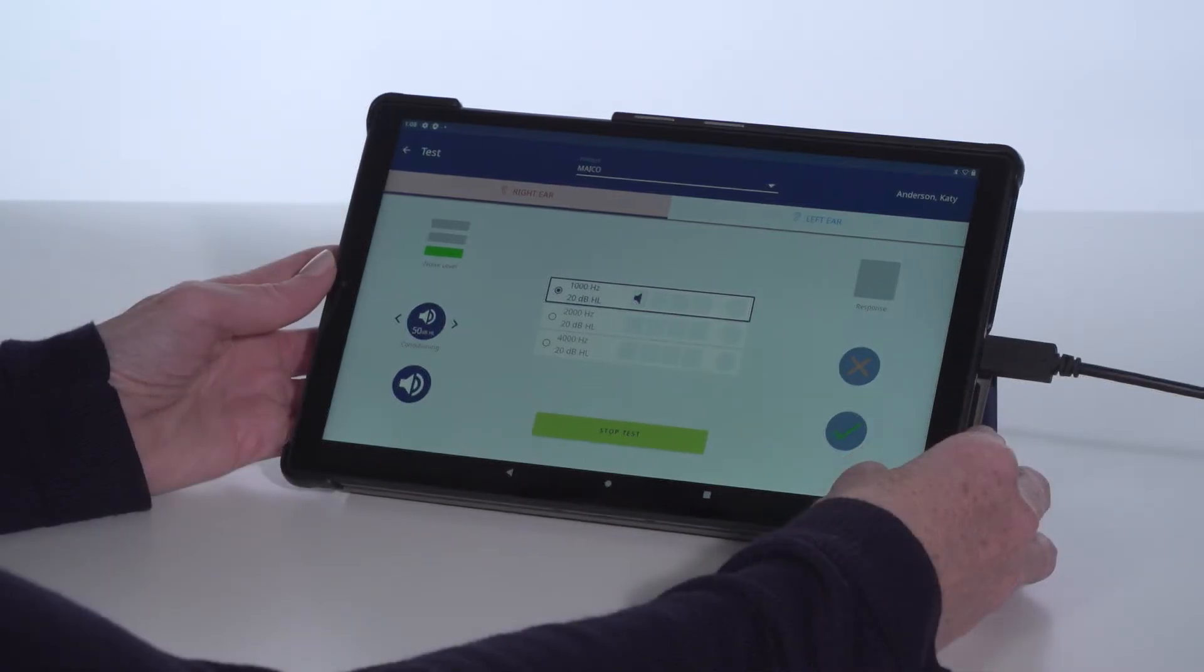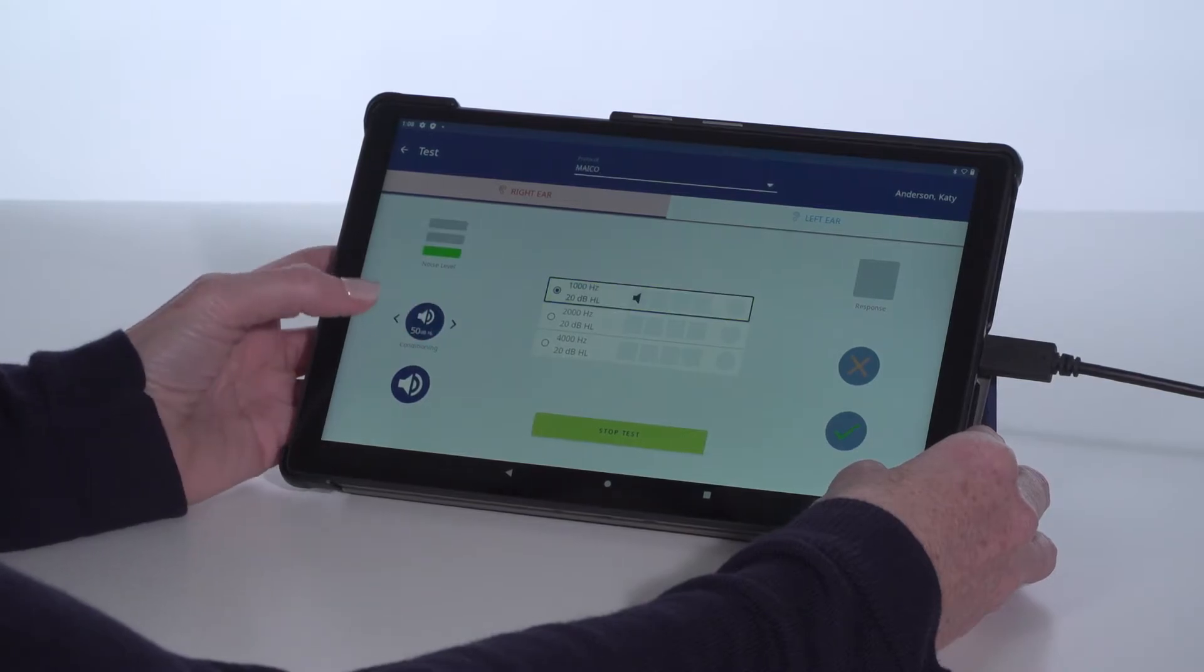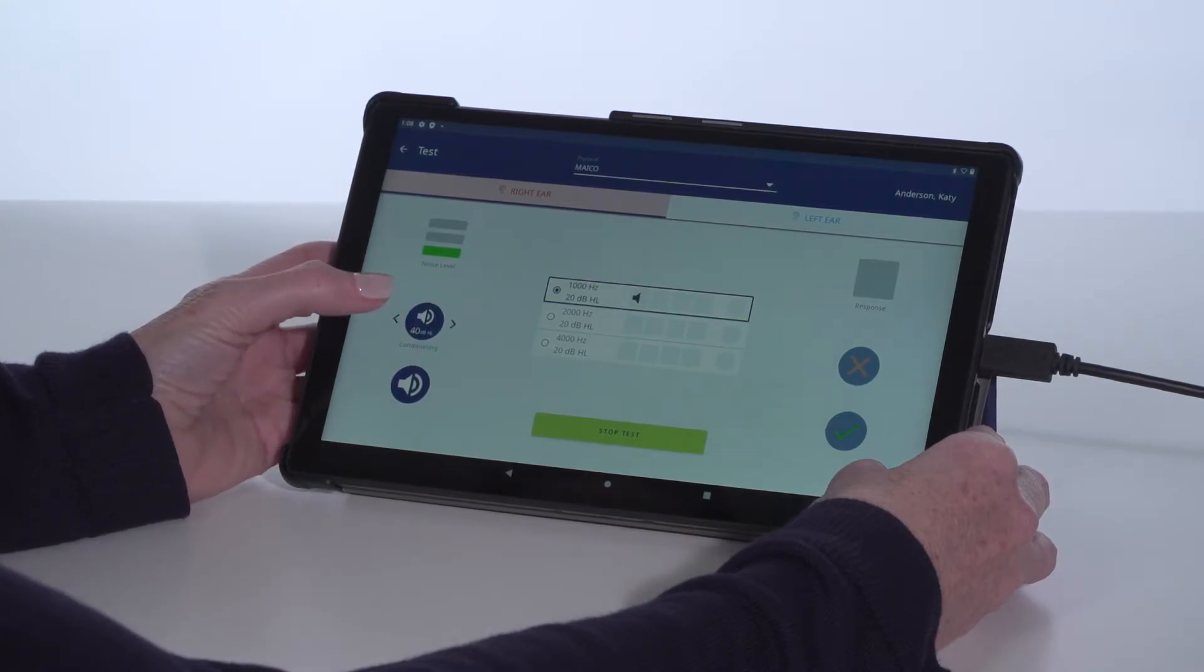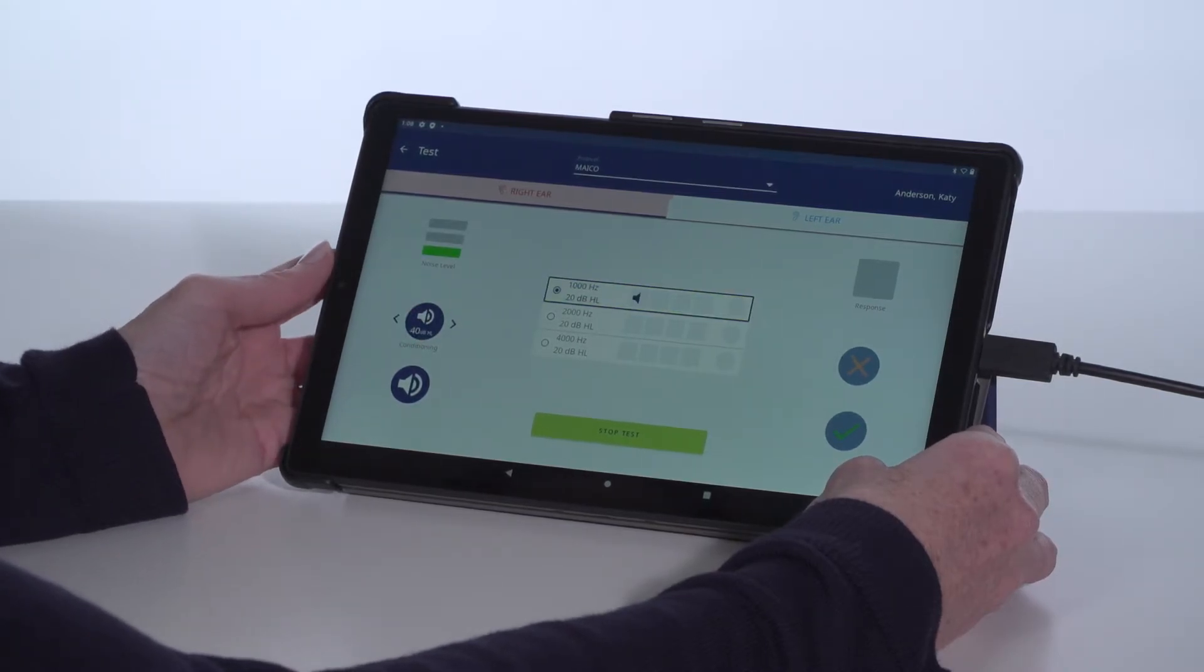When conditioning is needed to train a child on the hearing screening process, select the preferred level and the Conditioning Present button.